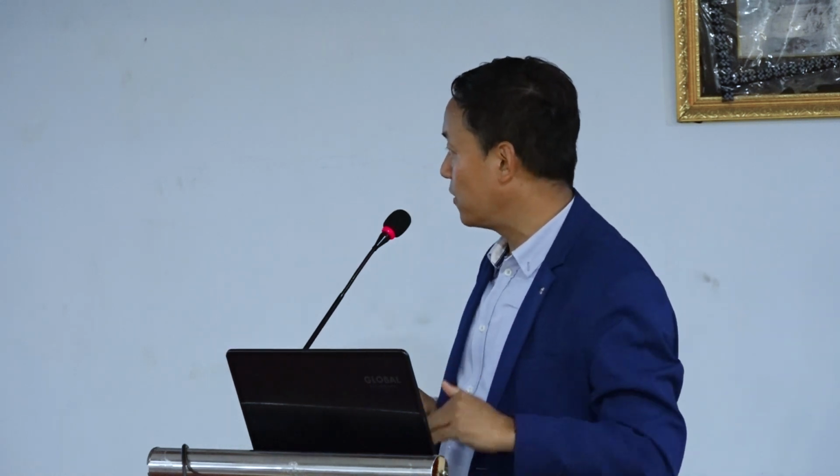I'm trying to remove and nothing is coming. So now I decided I should not do more. I decided I should have done this before actually. I later realized that I should do it now. And I actually put a capsular, a pupillary stretch iris hook, and then now I don't use this again. I use my ring instead of this. And then now the cortex is very easy to remove. You can see all the cortex, you can see the capsule, everything is visible in front of you, and it's easier to complete your case.